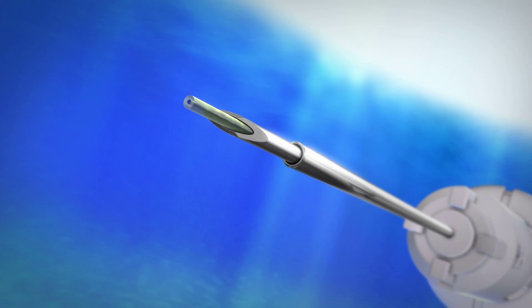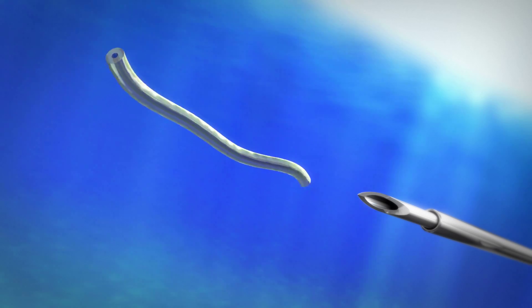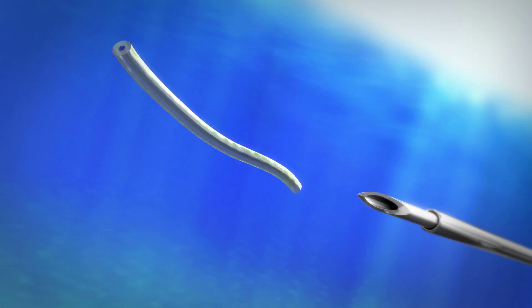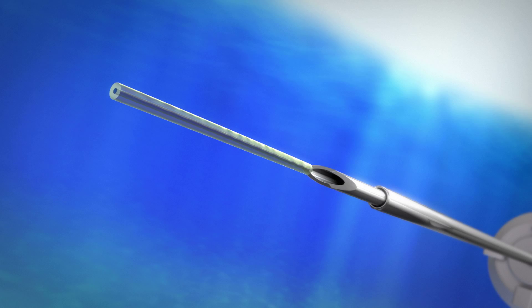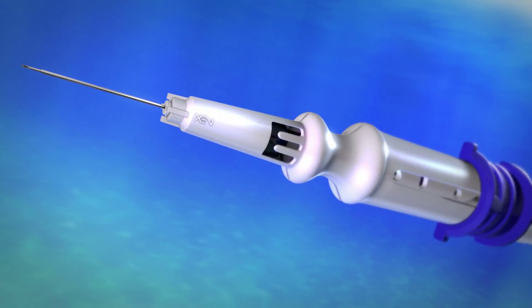The ZenGel stent is six millimeters in length, and when hydrated, it becomes very soft, compressible, and tissue-conforming. The gel stent is preloaded in a disposable injector with a 27-gauge needle.